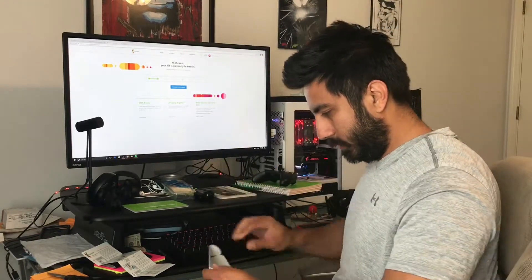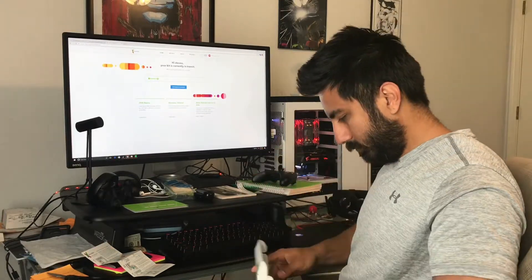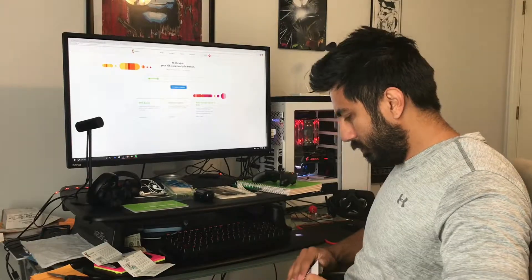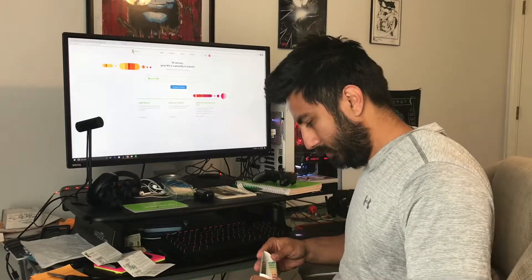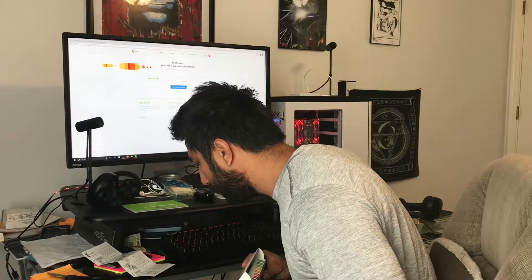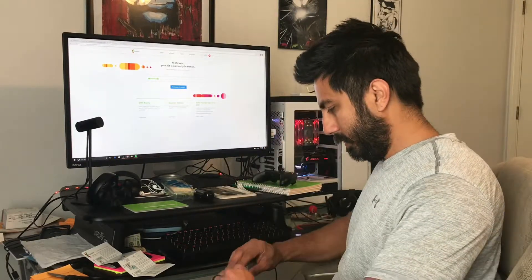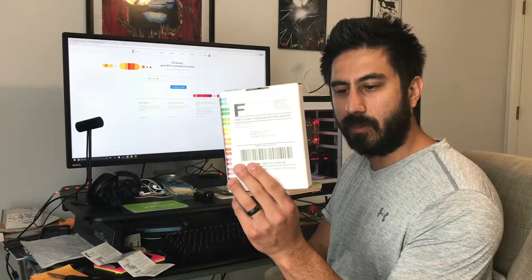And that's actually it — I peel off the label, the box has the shipping already on it, and I don't need to add anything else. The shipping label is already on the box, so I am completely done.